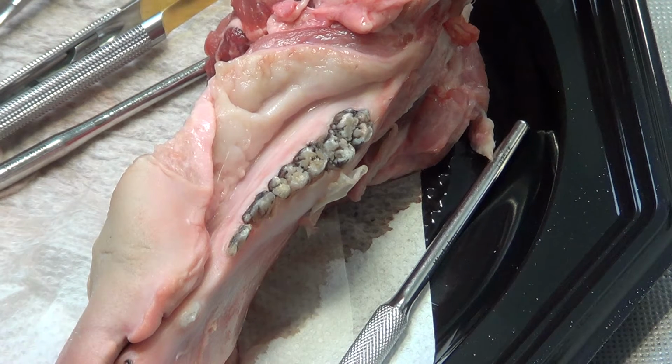Okay. So, if you have obtained, for example, 12 millimeters of free gingival graft, do the first incision in the mucogingival line of 12 millimeters. If you need help to stabilize, the incisions should be longer than the graft. Yeah, absolutely.